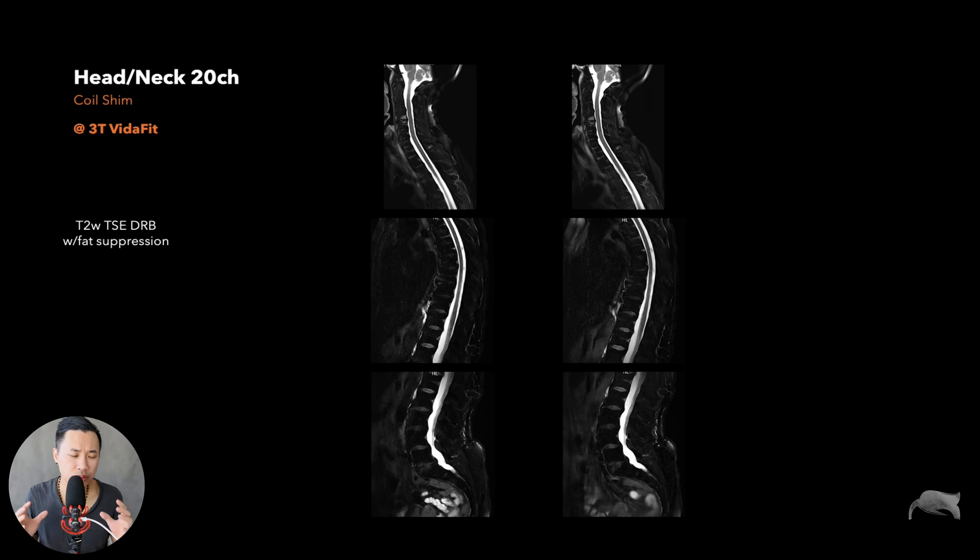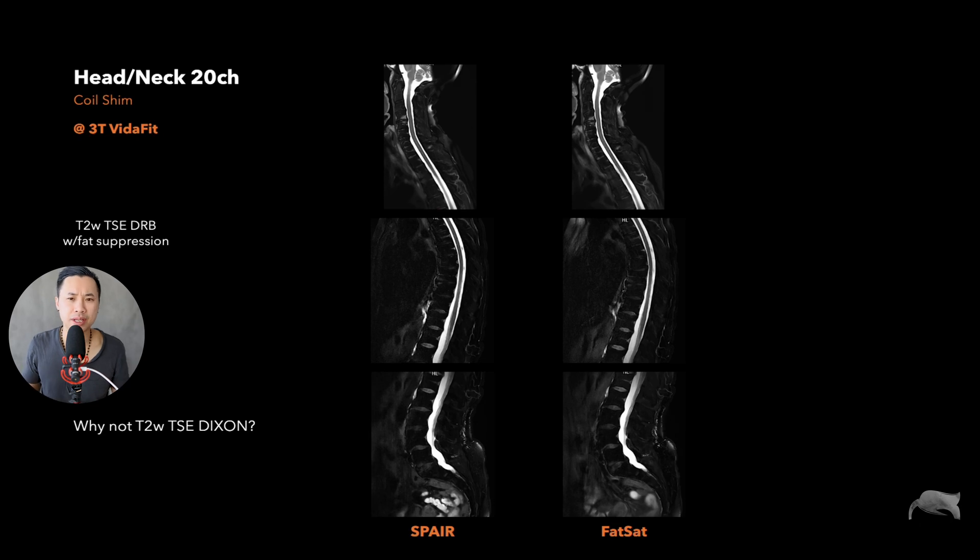We're still using the same T2 TSE fat suppression setup. I want you to look at both images and tell me which one is best. The first impression: both look great — the suppression is good and the homogeneity is good. Let me reveal it: on the left is SPAIR, on the right is fat sat. Both are good. Why not Dixon? For this test I wanted to use SPAIR and fat sat specifically because they are faster and can be combined with DRB, whereas Dixon only works with DR. So SPAIR and fat sat give you the full deep learning package — that's why I wanted to test this.